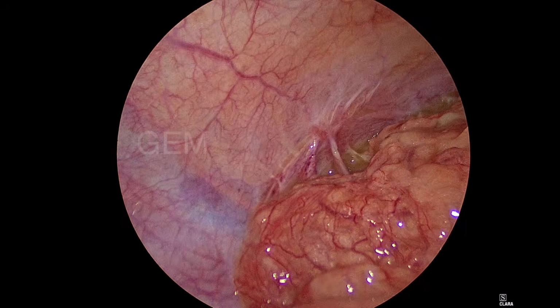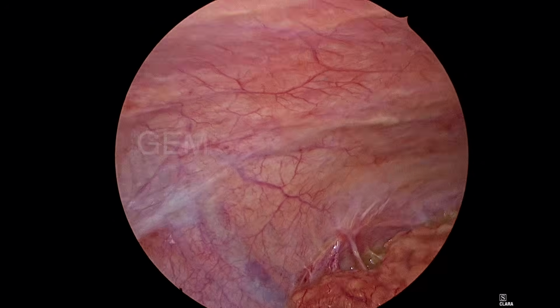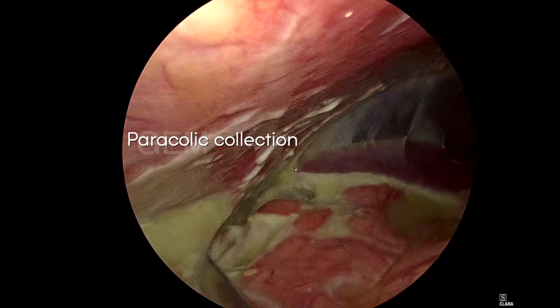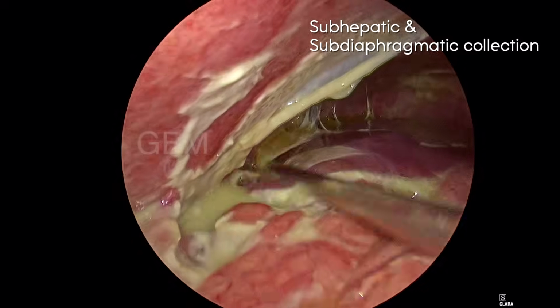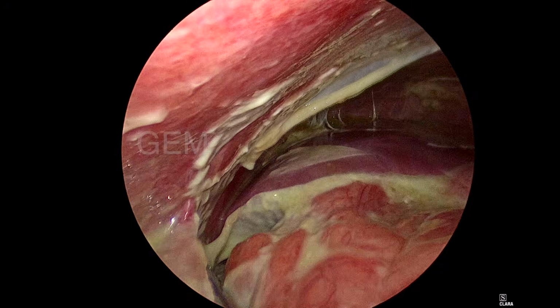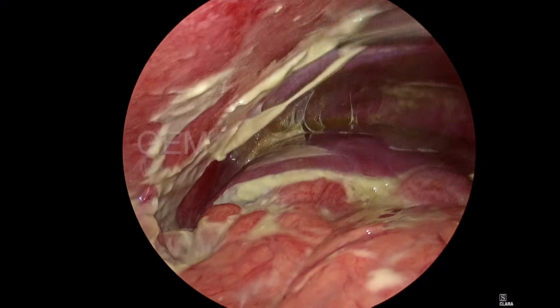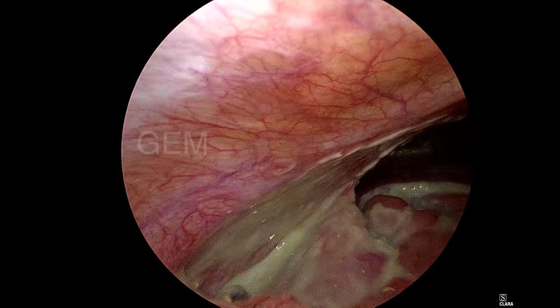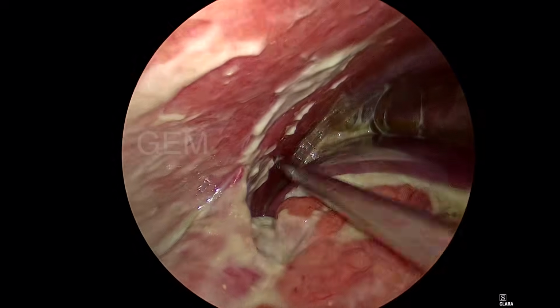Taking the camera in the suprapubic port, you can see the omental covering in the right iliac fossa. There is a lot of collection, frank pus in the paracolic region, subhepatic and subdiaphragmatic regions, thick pus. It is a delayed presentation. The patient was admitted in an outside hospital, where with a history of diarrhea they treated it like colitis, and already he developed peritonitis. Fecal matter is also coming from the perforation.